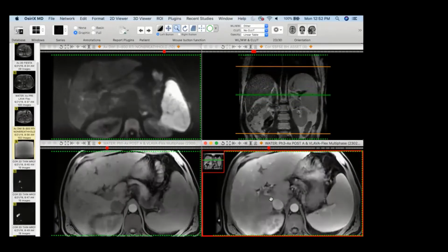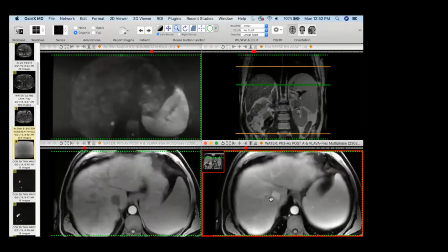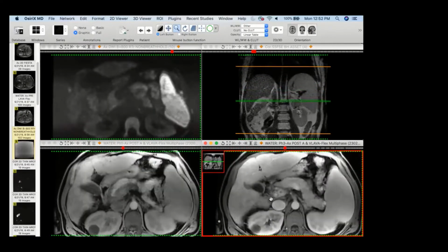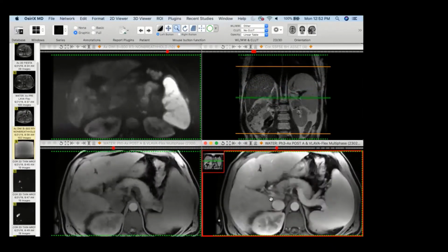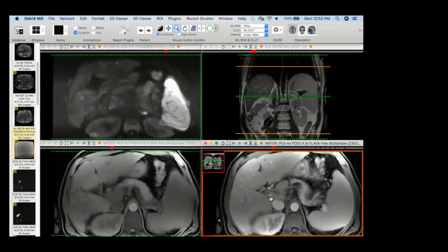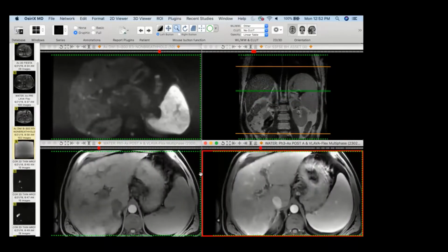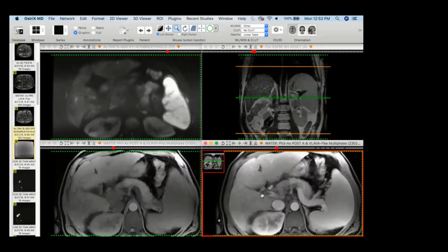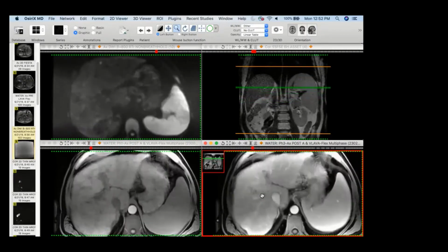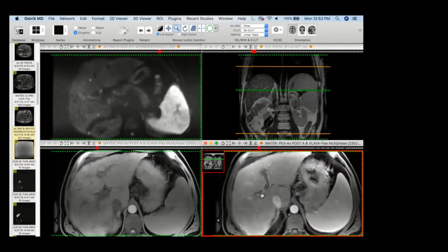Would you think about something specific because of the portal vein findings? Well, obviously with cirrhosis, you want to make sure it's not tumor thrombus. But otherwise, if you get abscesses, it's frequent to also have associated septic thrombus of the portal vein. I call this LR-M. Clinically, he didn't look like he was infected, so I didn't raise infection as a DDX, and I recommended biopsy.